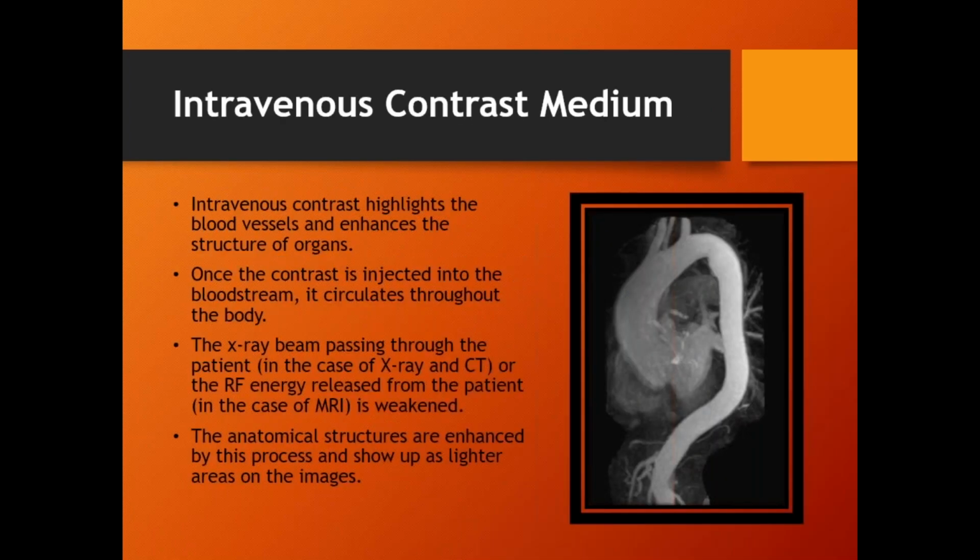All right. Now the intravenous contrast highlights the blood vessels and enhances the structure of the areas.